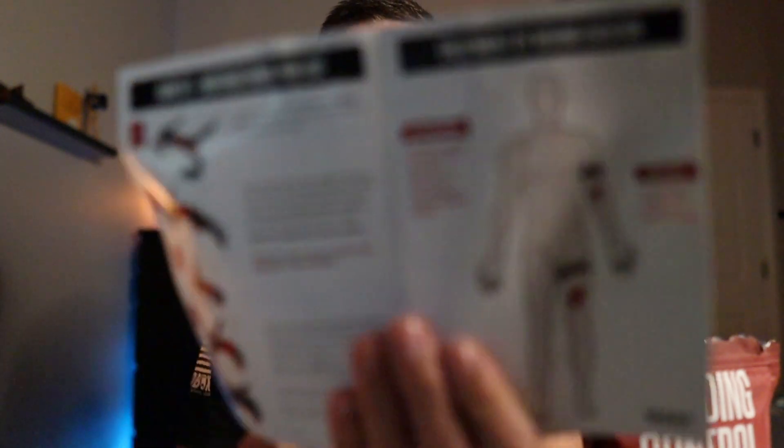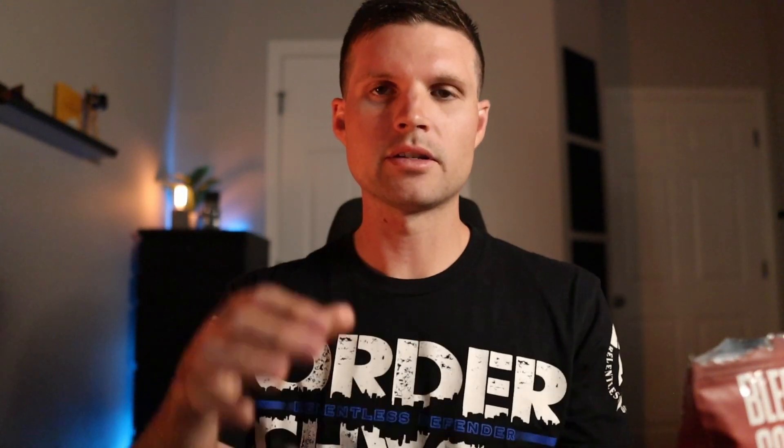You have a little instruction manual — pretty simple instructions, but in a panic it's kind of nice to have instructions, especially for anybody who's never had any experience with this. You've got an emergency bandage. This is a bandage that tightens down real tight and it has a little hook in there, so it hooks and keeps it tight so it doesn't come loose. You've got a marker. Why do we have a marker? Because you need to jot down the time that you put the tourniquet on — that helps the doctors at the hospital know how long it's been on there so they can address that.